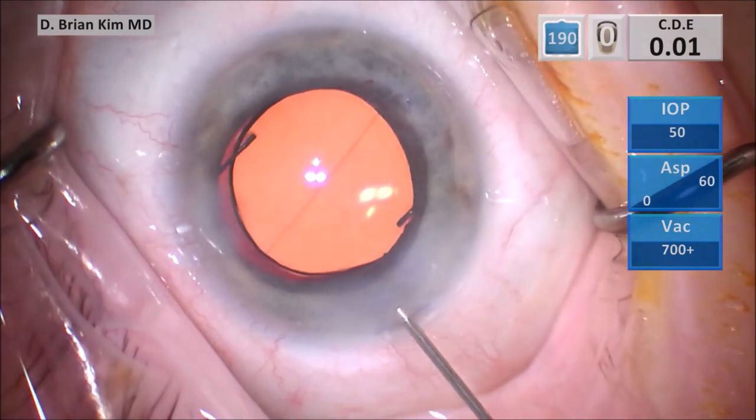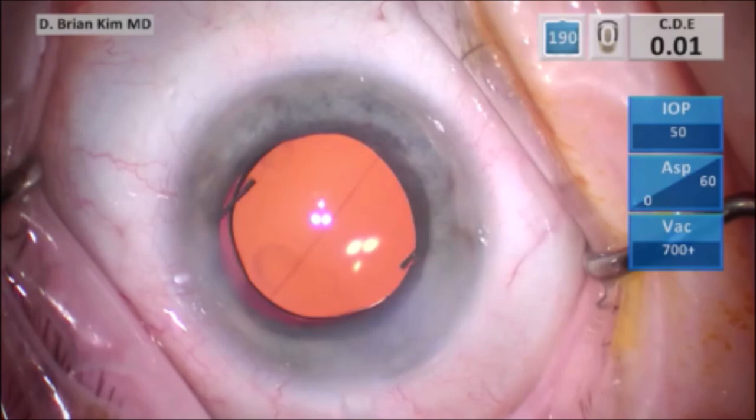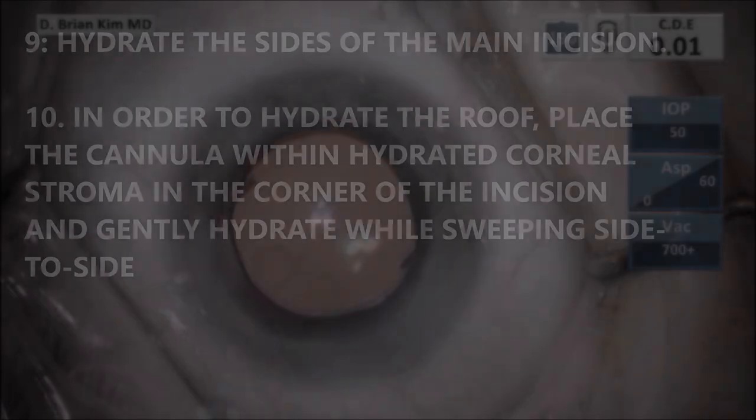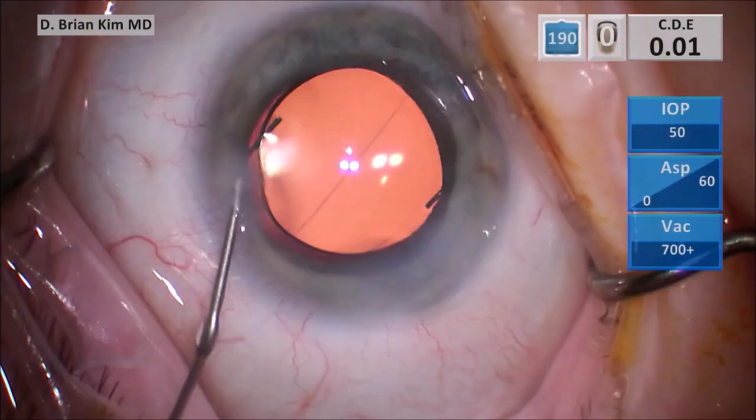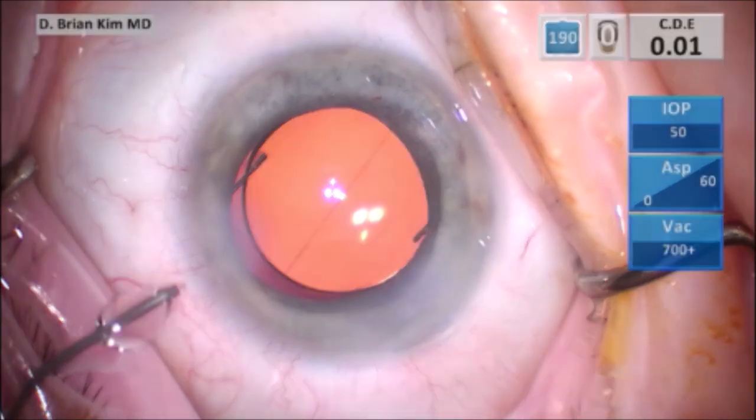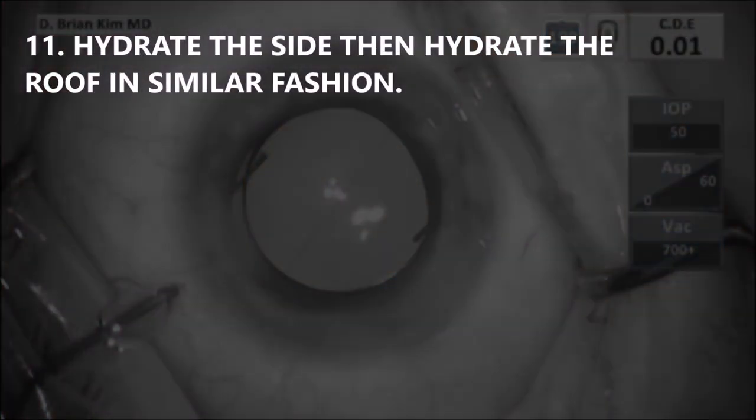This creates little areas of hydration. Number nine: hydrate the sides of the main incision. Number ten: in order to hydrate the roof, place a cannula within the hydrated corneal stroma in the corner of the incision and gently hydrate while sweeping side to side. Number eleven: when hydrating the paracentesis, hydrate one side and then hydrate the roof of the incision in similar fashion.